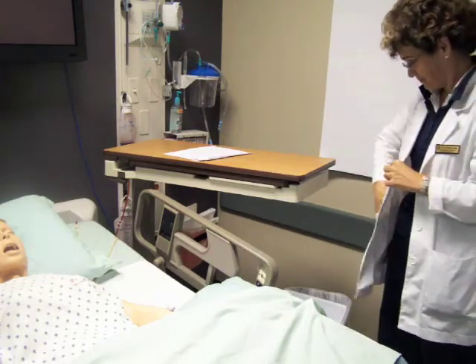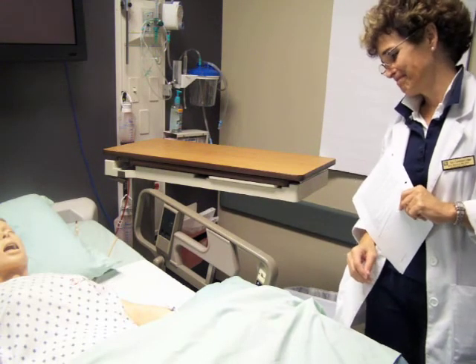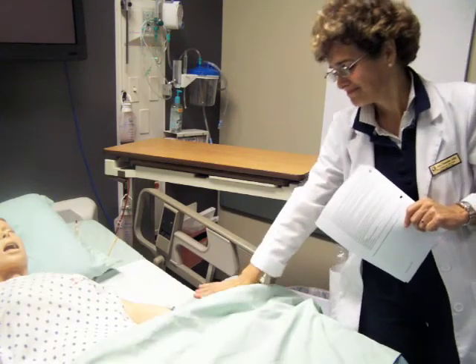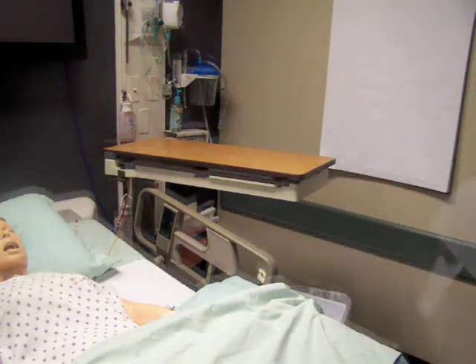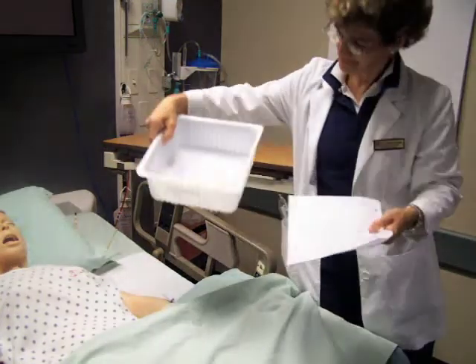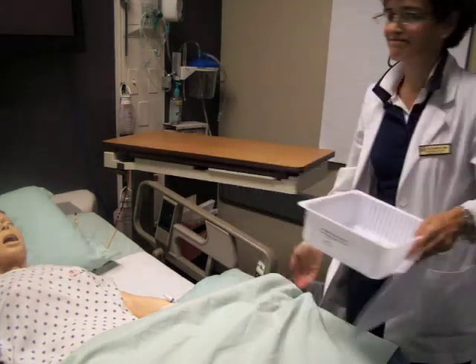Document IV push on MAR. Observe and assess client for any variances to the expected response to the medication. Document any such variances. Whenever practicing skills on the mannequin, be sure to reset the mannequin in its original position and retrieve your supplies.